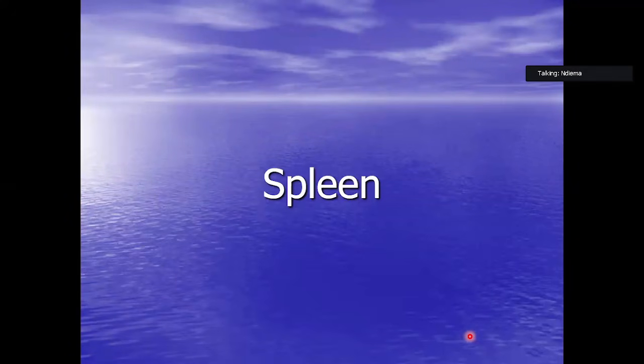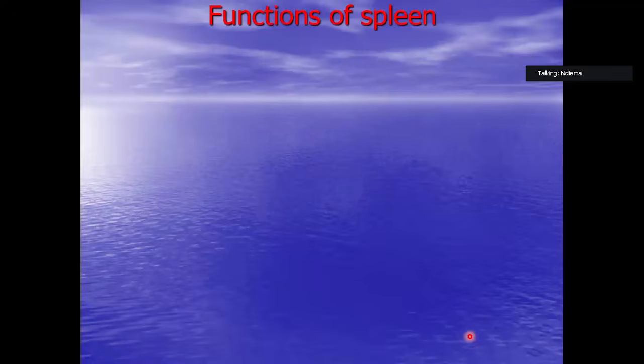We have finished the lymph node, so let's look at the spleen. I think that's where we are supposed to start today. The spleen, as you'll be aware, is associated with the greater curvature of the stomach. And histologically, if you cut a spleen, it comprises white spots, and these white spots are what we refer to as the white pulp, and then the red pulp. The red pulp is red because it contains a lot of blood vessels.